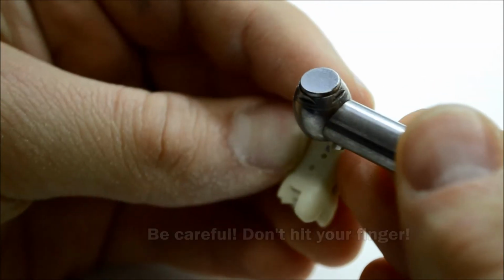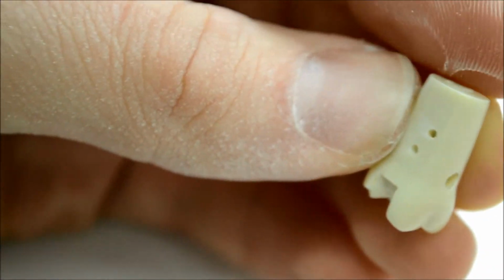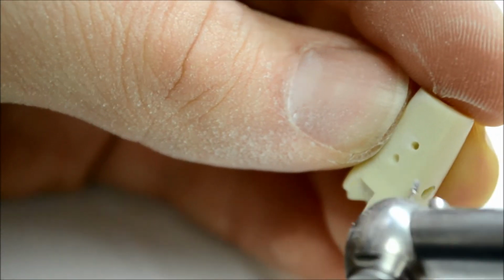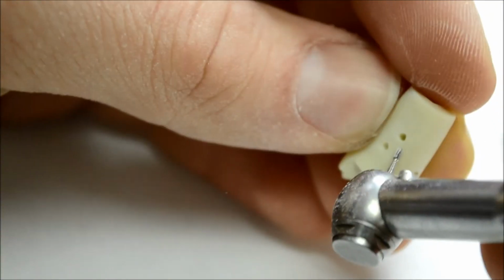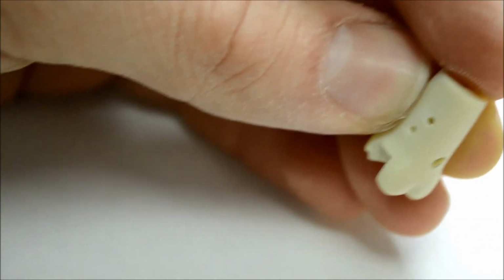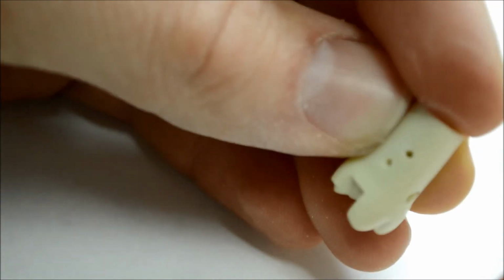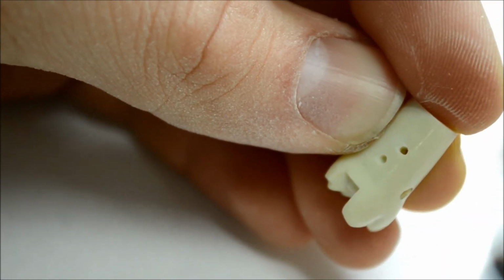And this one started to burn, and one way you can tell is you'll start smelling kind of a burning smell, and you'll see a brown mark in here. Now you can see a little bit better. The bottom of the hole is completely brown, and you'll see a lot of that starting off, but try to minimize it. Try to learn how to stop doing that.